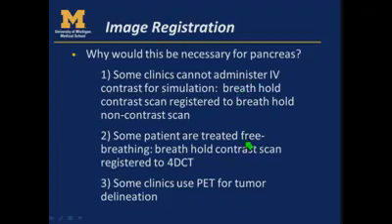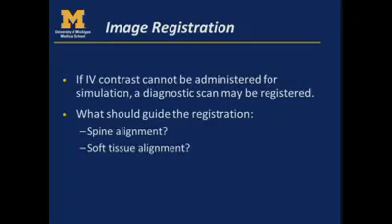Some patients are treated free breathing, and we need a breath hold contrast scan, though, in order to see the tumor. So then many patients have a registration of a 4D-CT to a breath hold exhale contrast enhanced scan. And then some clinics are using PET to help with tumor delineation as well, so fusing that data set with a breath hold contrast enhanced scan is challenging.